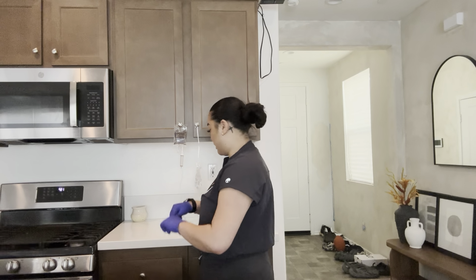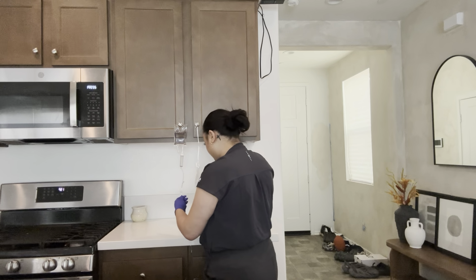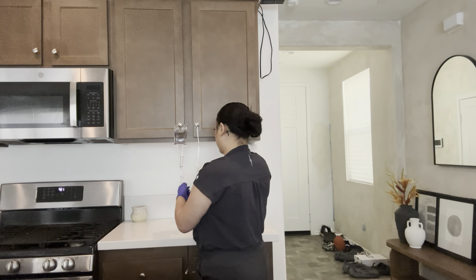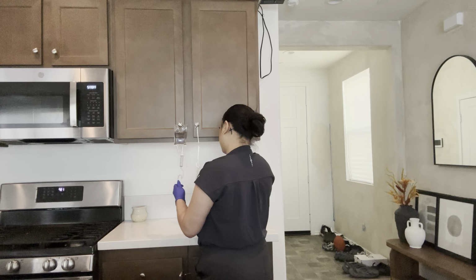Okay, all right. So I'm gonna use the clamp, time it, and adjust the clamp as I go if needed. We're doing this for 1 minute.